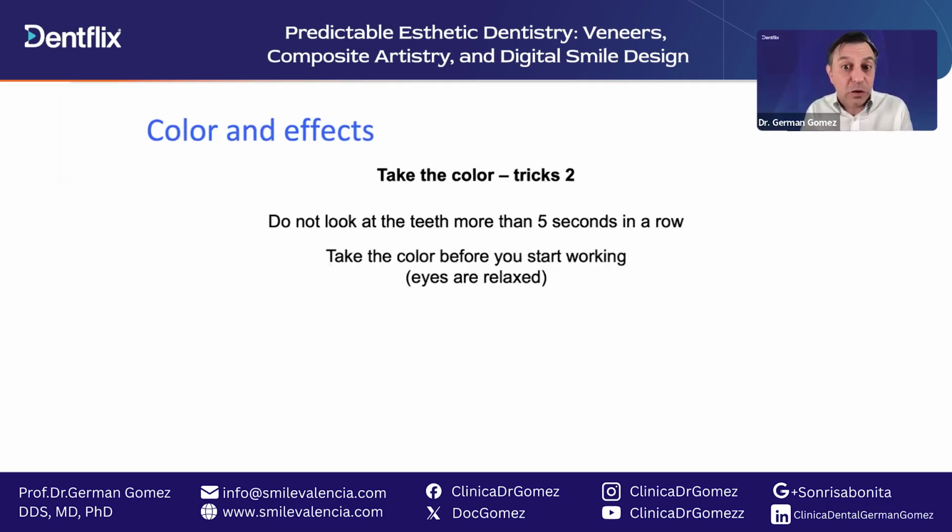Take the color before you start working, while your eyes are relaxed. The usual thing most dentists do is they work, they make the preps, the impression, they make the provisionals, and then, oh, the color, okay? And then they go ahead and take the color. But their eyes are tired in that moment, okay? They were so concentrated in doing all other stuff. The eyes do not see correctly in that moment, okay? So start to take the color before you start working.